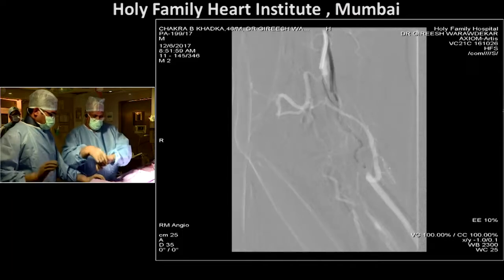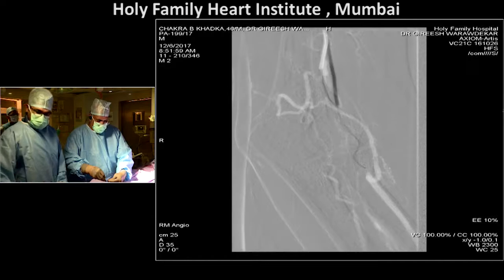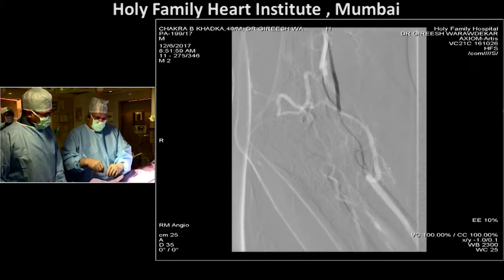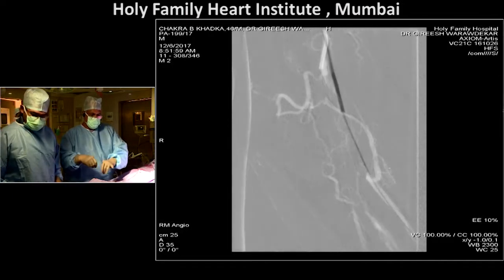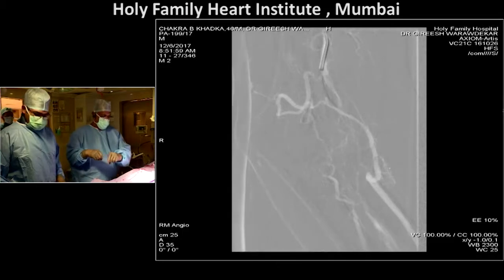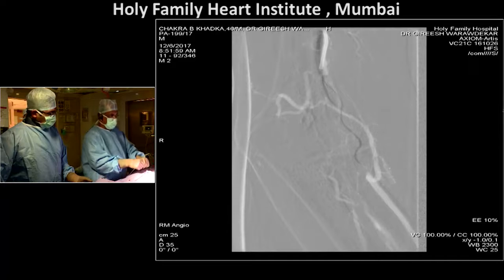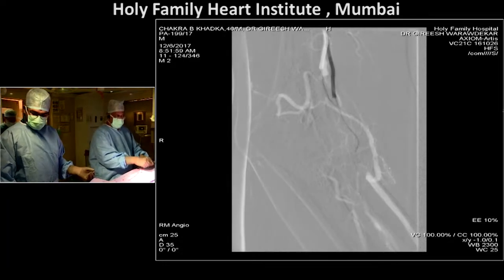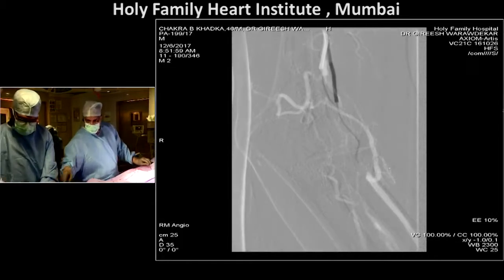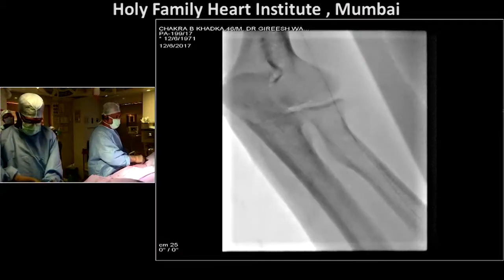Okay. So Girish, what's happening now on your side? We are seeing you are exchanging something now. I was a little skeptical of doing the retrograde because already he's got an ischemic limb. And if I stuff up that vessel, which was the only supply, the radial, I was a little scared of that. I was lucky that I could cross. In the audience, what I'm worried about now is, sorry. Yes, Girish.